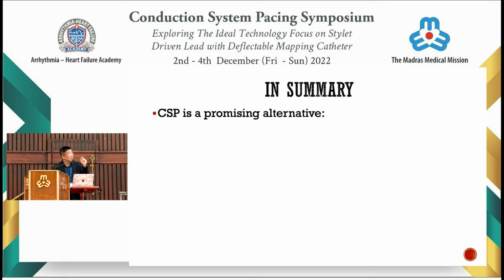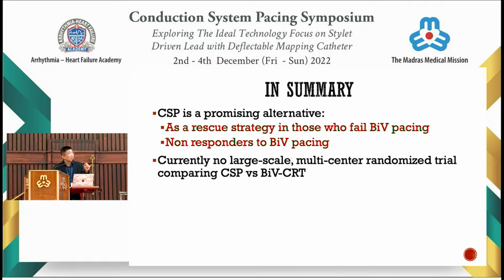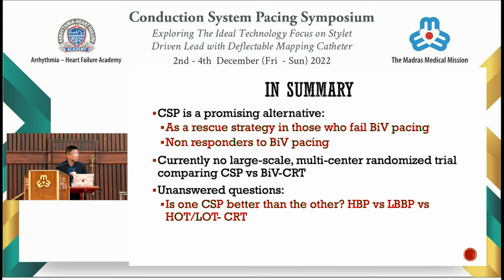So in summary, conduction system pacing is a promising alternative. As a rescue strategy, especially in patients with non-responsive biventricular pacing, it's certainly something that we can try. Currently, as mentioned by previous speakers, there's really no large-scale randomized trial to compare. There are many unanswered questions.